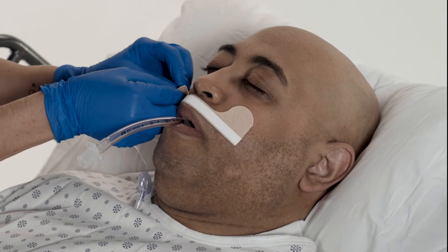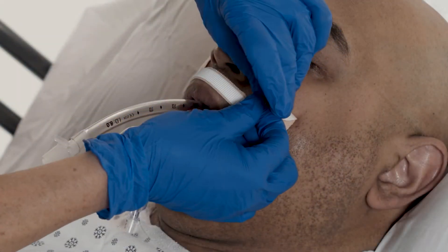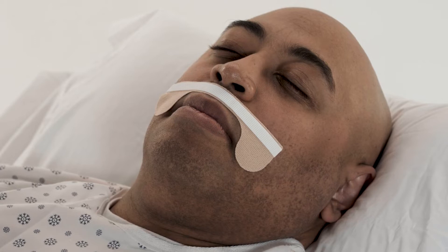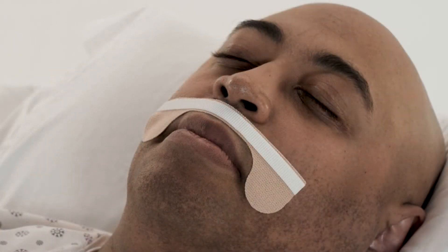Remove the liners remaining on the base at each cheek. For patients with a small face or an injury on the cheeks, apply the base tabs down.